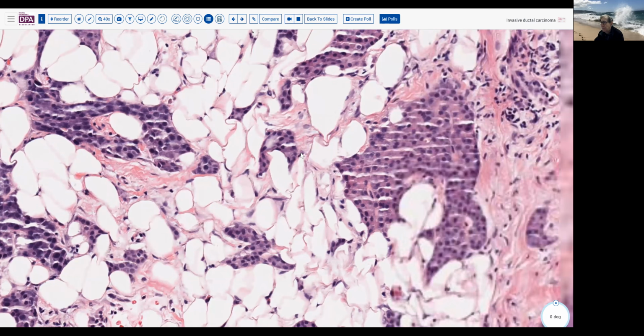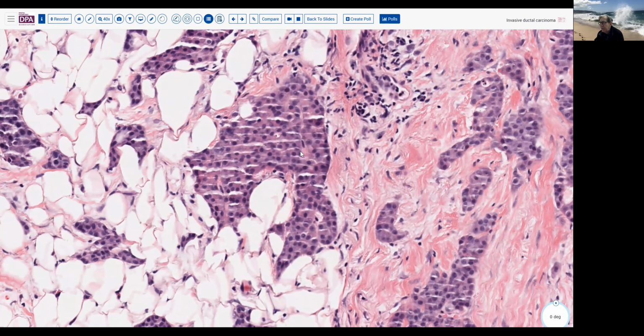Now, obviously, mitotic score, being based on consecutive high power fields, is influenced by tumor cell density. So a tumor field that is totally filled with tumor cells is probably going to have more mitoses than a field such as this, where the tumor cells are quite widely scattered.